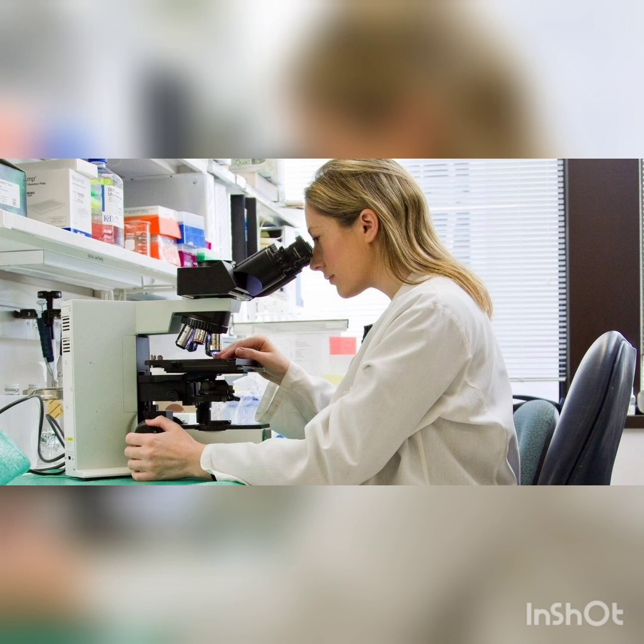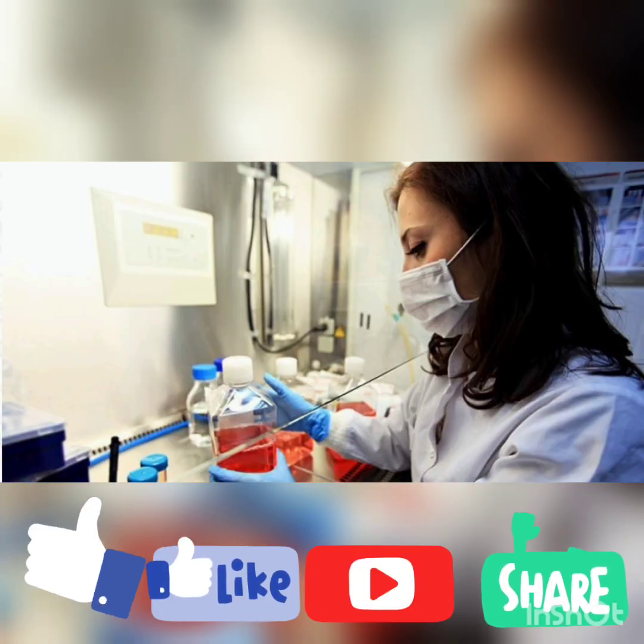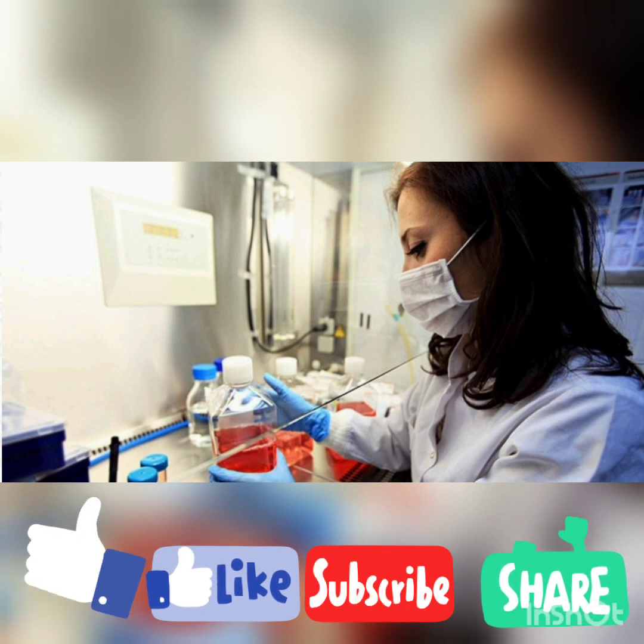Next, pieces of hair and scrapings from the skin and nails, which are submitted to the laboratory for fungal culture, you can keep at room temperature for several days before inoculation. There is no problem. There is no need to keep them in the fridge.